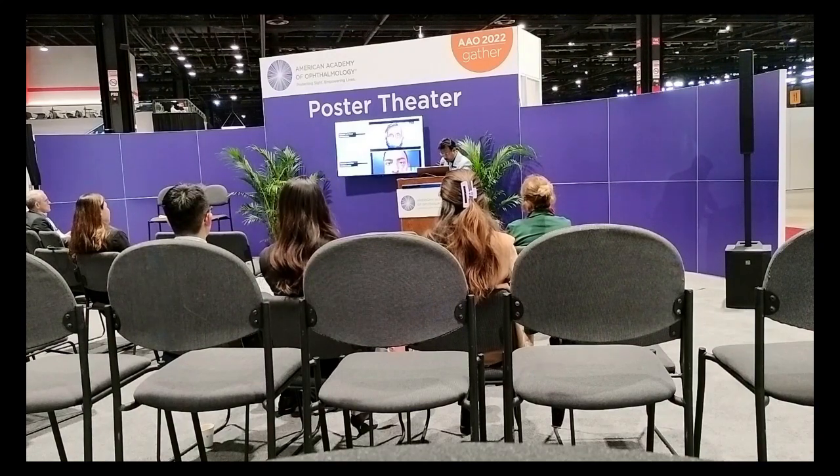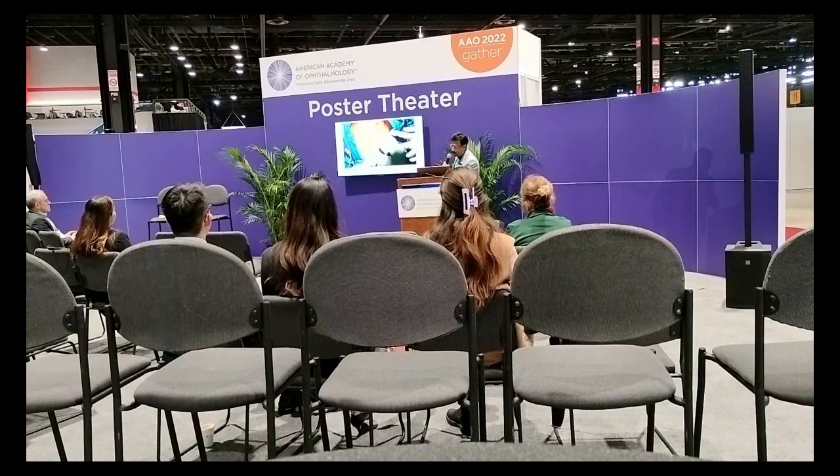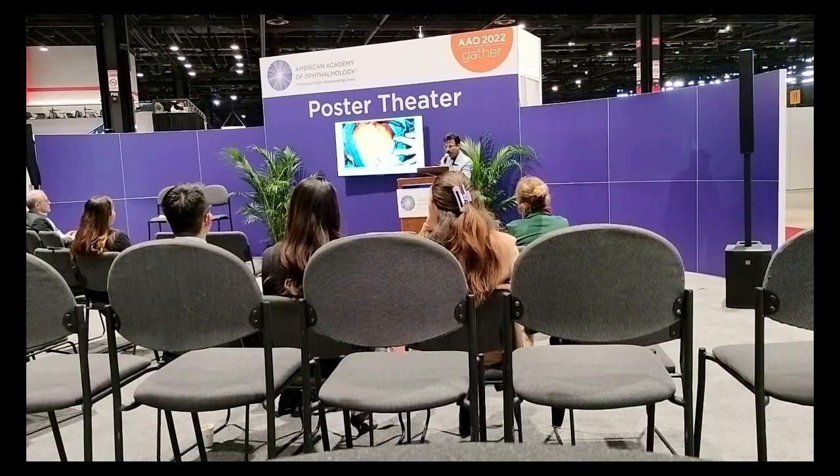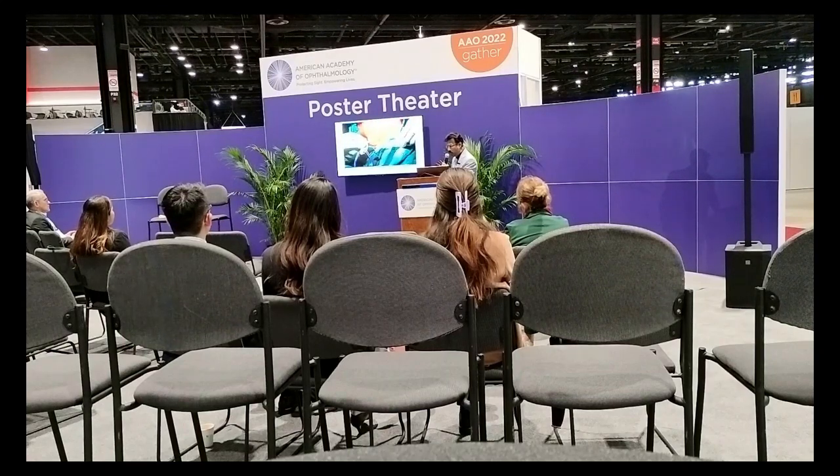Now comes how to do it. This is a tumor, lower lid basal cell carcinoma. First we have to expand. The ellipsoid area is marked in the temporal region. A single axis dissection starts from the long axis of the ellipsoid area. It goes over the periosteum, over the bone, and the skin muscle complex is expanded instantly, simultaneously. The catheter goes 1 centimeter beyond the level of the ellipsoid area, then it is expanded.